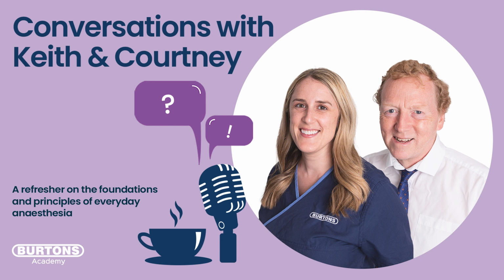You had a very efficient brain doing all the feedback for you, looking at the CO2 levels in the body, moderating respiratory rate and depth, all very nicely, to keep CO2 levels absolutely normal. And now you've taken away that capability of the brain. So the big thing then is that it's all down to you. You've suppressed that respiratory drive. You're now the part of the feedback. You have to make sure that you're giving sufficient minute volume, and more particularly sufficient alveolar volume, that the patient gets enough oxygen and is able to get rid of CO2 and maintain it at normal levels.